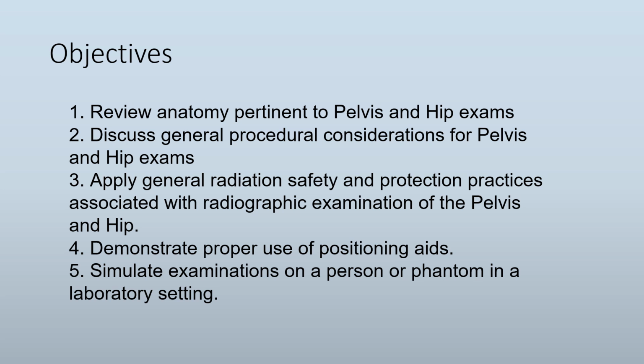As far as patient preparation goes, if you fail to do that step, you will be repeating the radiograph. That is, if you have an eye for quality and you have actual standards that you're practicing with. Right? We don't want to rip off the patients and give them a half-assed exam. Let's get that stuff out of the way. It only takes 5 seconds.